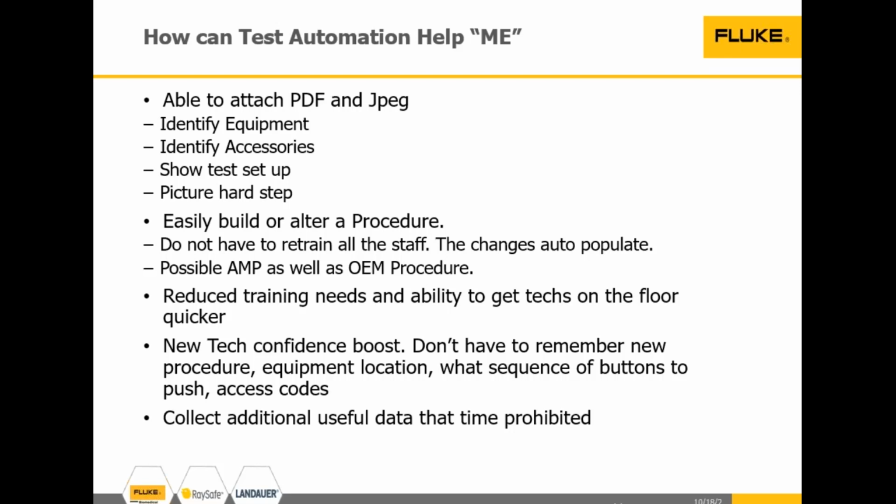So you run up to the OR, you got your bag, you set it down, monitor's on and working great. Are you going to do a full PM work order on that? You're going to spend 2 hours doing that entire PM? Or do you want another procedure that's just a checkout procedure? Real quick, step 1, is it on? Step 2, is it plugged in? Step 3, connect your patient monitor, does it read? Good, leave.